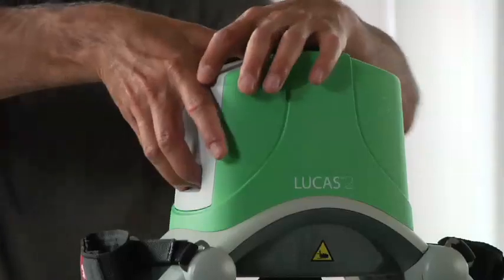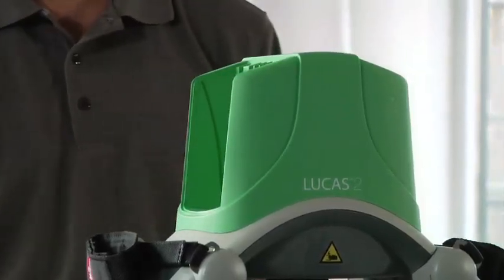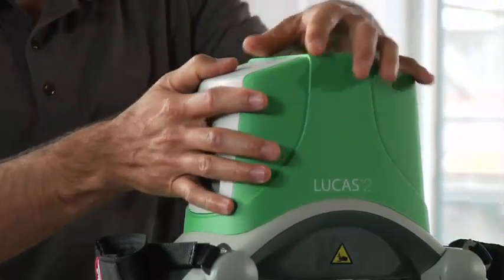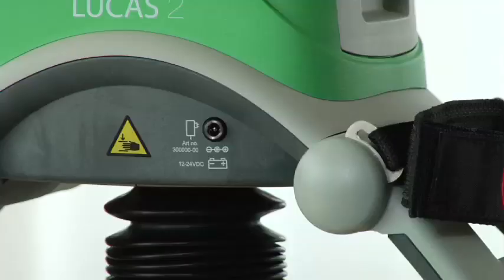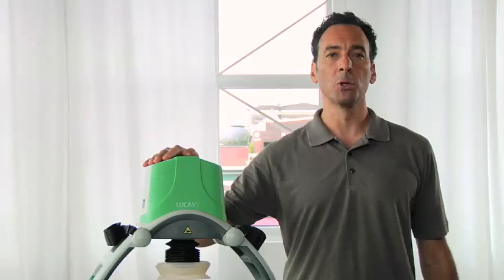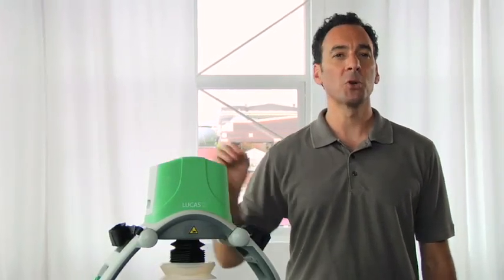To change the battery, pop it out and put in a fresh one. You can plug in the external power supply if you're using mains or car power. But remember, the battery must be in position for Lucas to operate, even if you use external power. To minimize interruptions, always have a charged spare battery available.